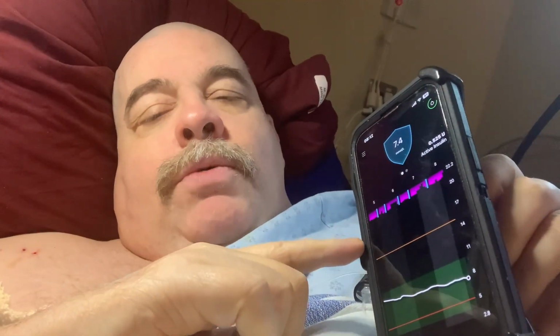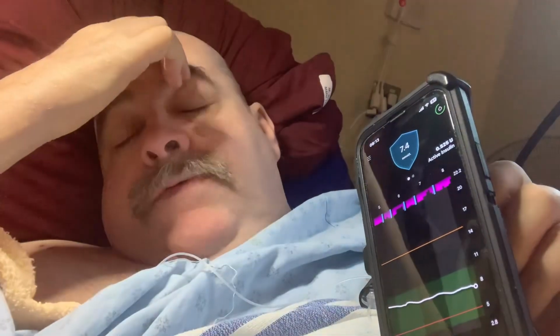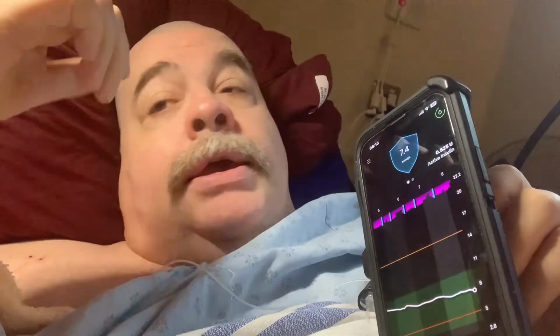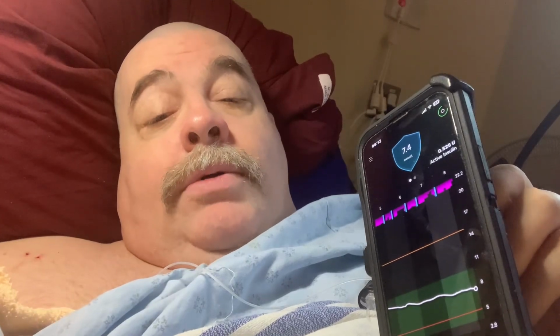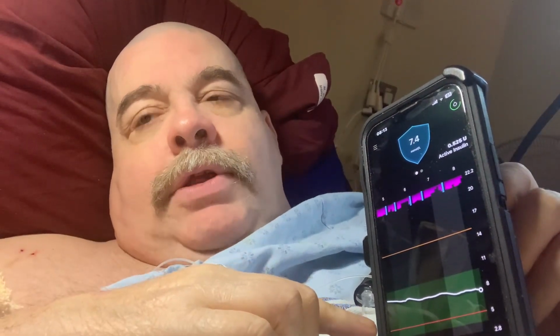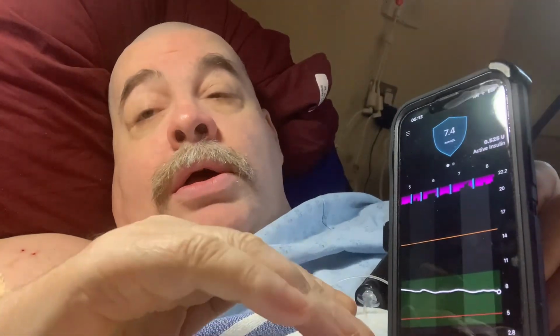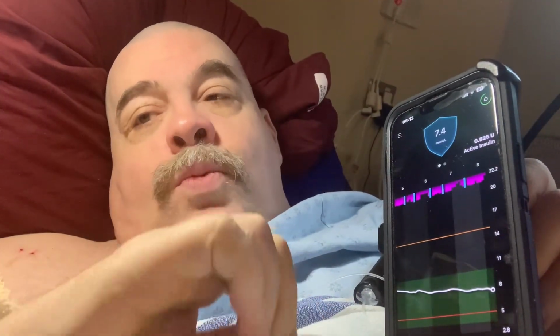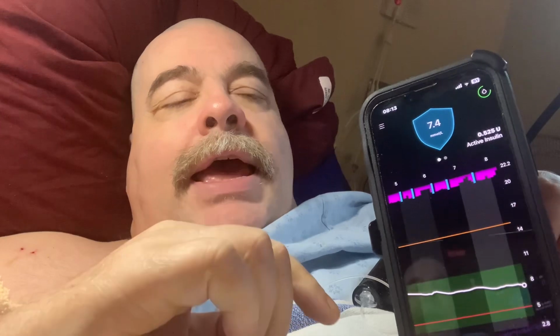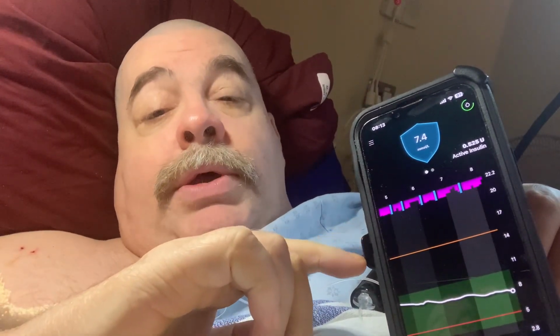If you start going high, it has an alarm for that. If you are approaching a high, you can also have that alarm. If you're dropping low or trending low, you can also have an alarm. There are many different alarms. Having them all on does not work. You need to have certain ones on and you don't have to worry about the rest.